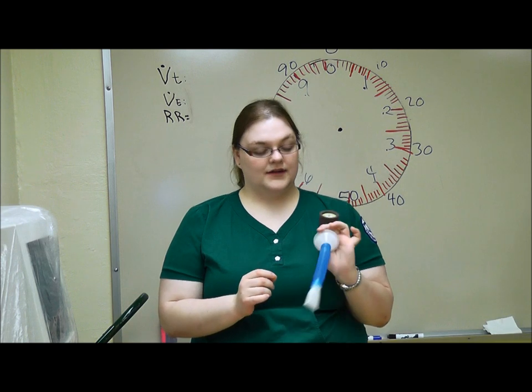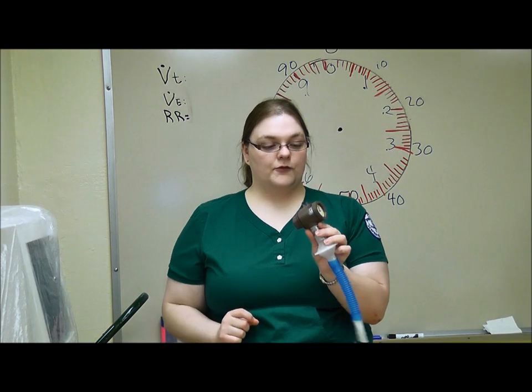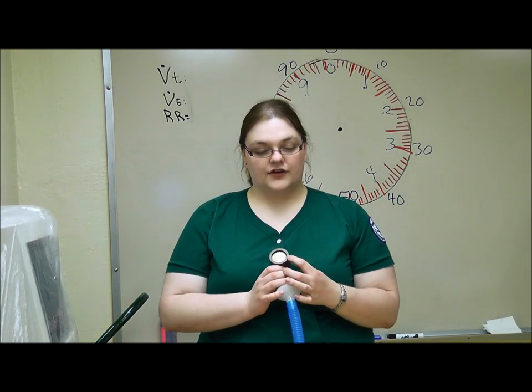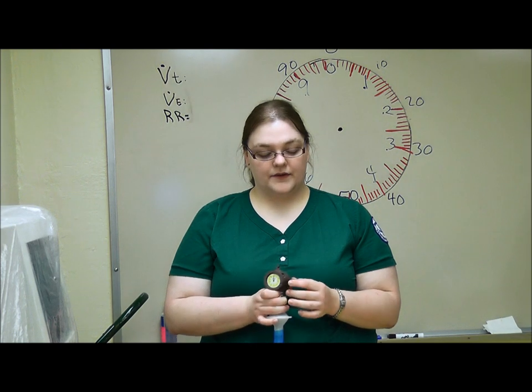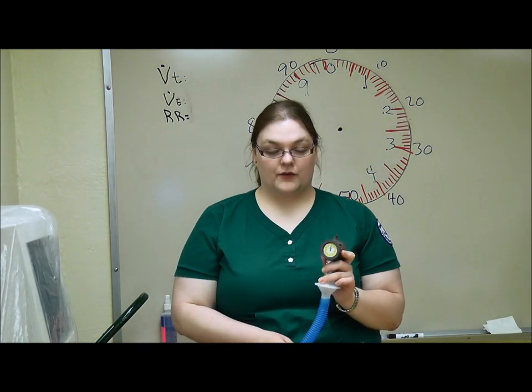The first step in reading a Wright spirometer is actually getting a reading. To do that, you're going to turn on the Wright spirometer with the power button over here on this model, and you're going to make sure that the dial is set to zero. You push the button over here. In that manner, it's very similar to a stopwatch.